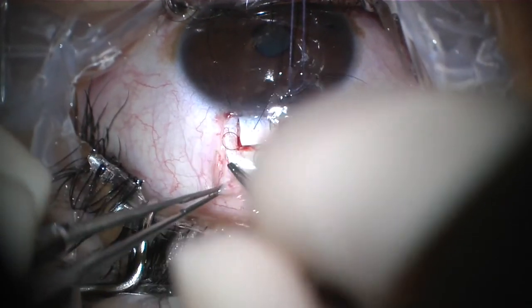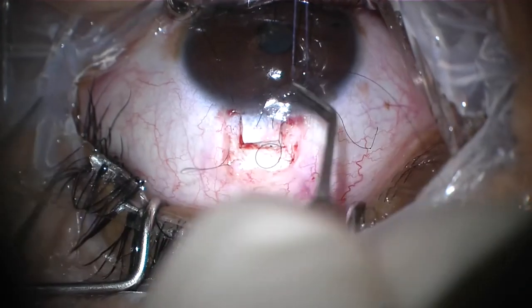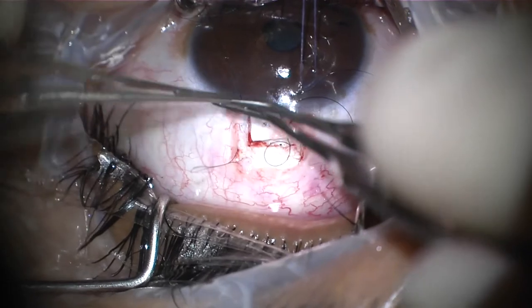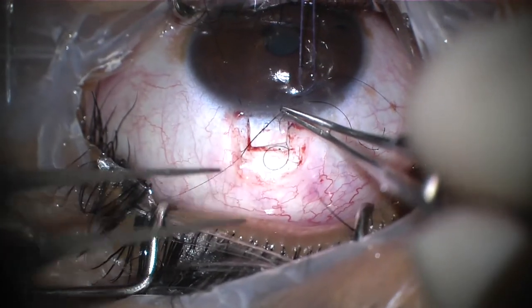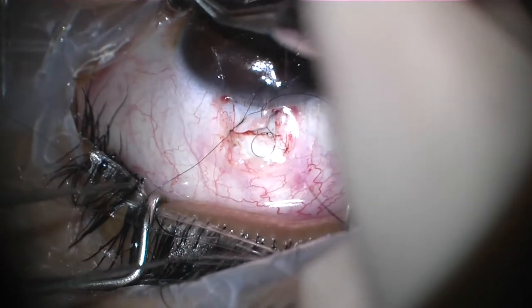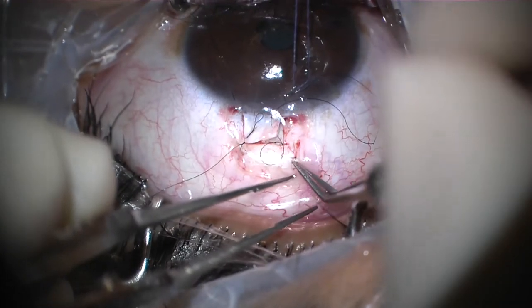Now it is time to tie the releasable suture. The free end on the scleral flap is tied to the scleral loop. The loop will stay on the scleral flap, so if you pull the corneal end, the suture will come out.